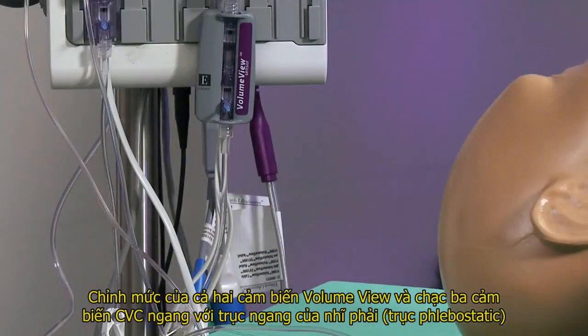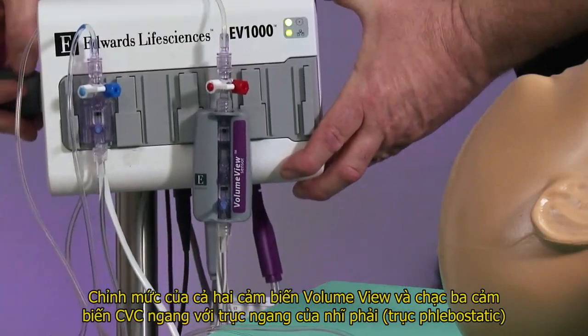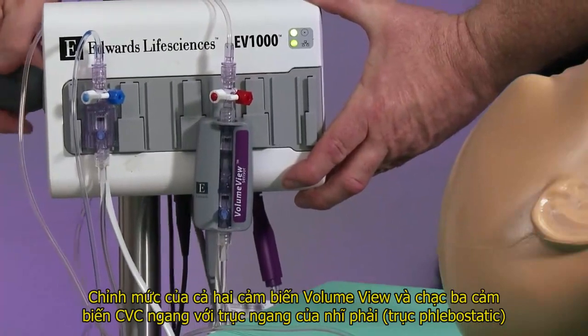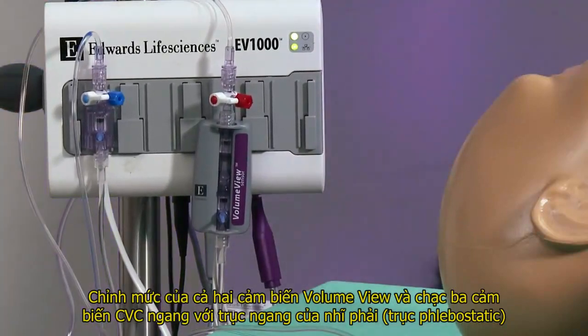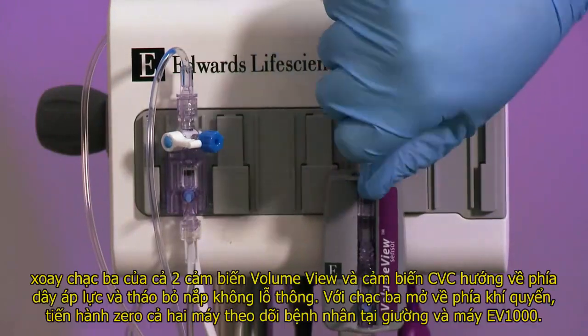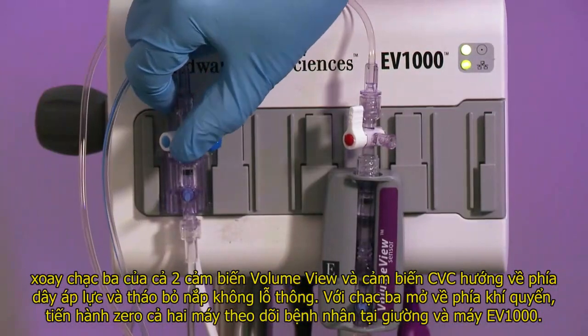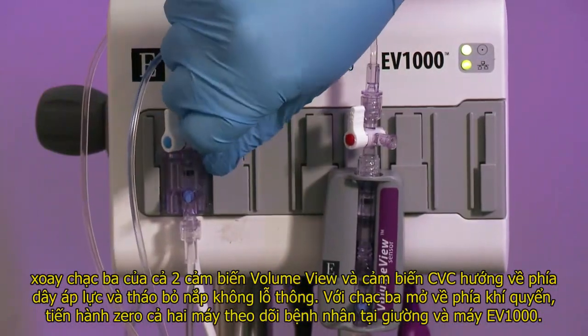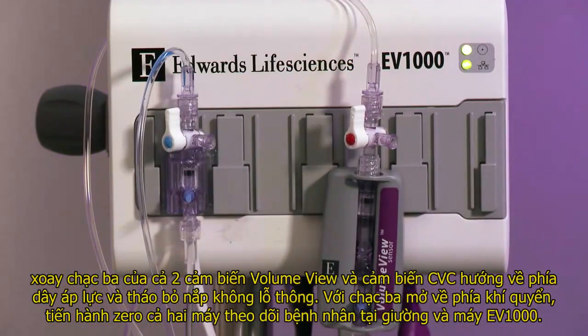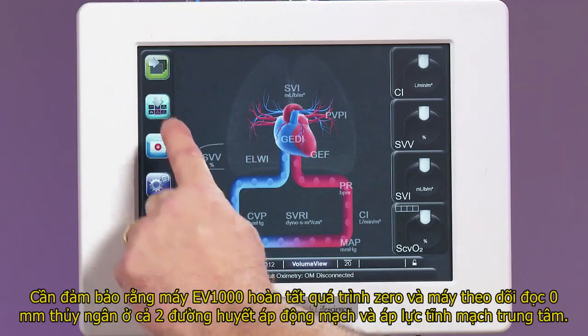Level both the VolumeView sensor and CVC transducer stopcocks to the patient's phlebostatic axis using a carpenter's level or laser leveler. Turn the reference stopcocks of both the VolumeView sensor and the CVC transducer toward the pressure tubing and remove the non-vented caps. With the stopcocks open to atmosphere, zero both the bedside monitor and the EV1000 clinical platform.